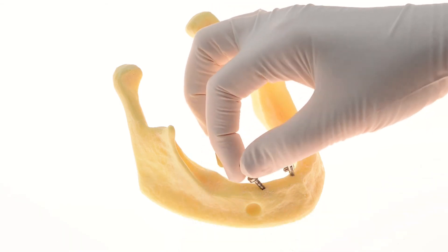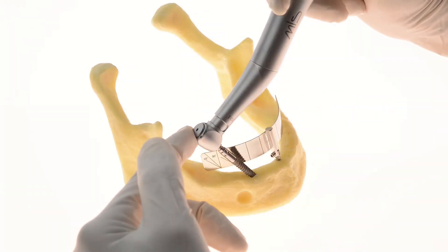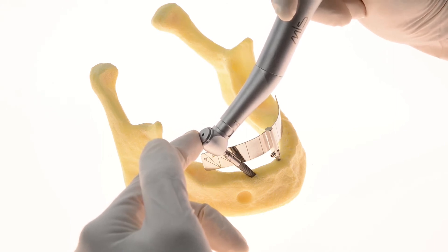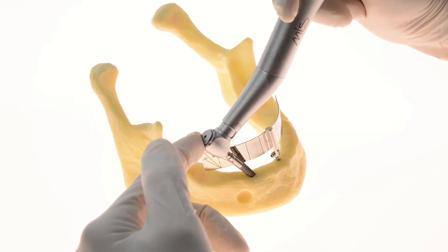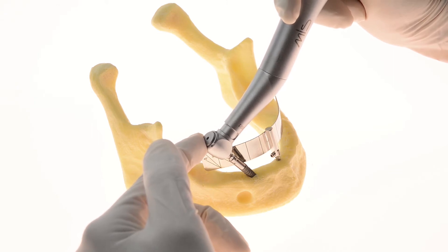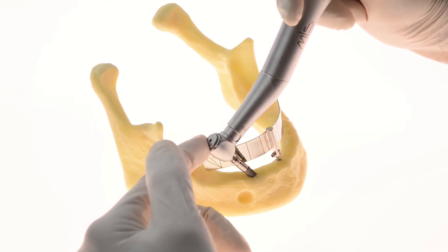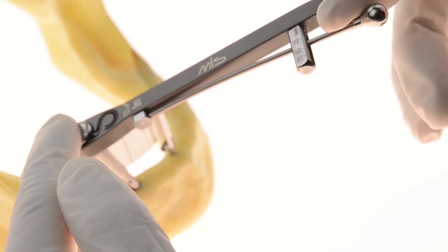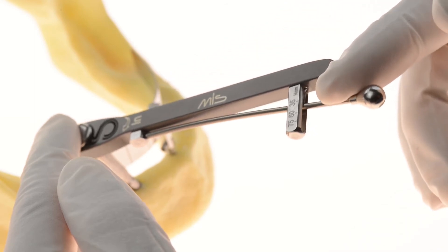After making sure you are in the correct implant depth, perform the tilted implant placement according to the MIS recommended insertion torque.